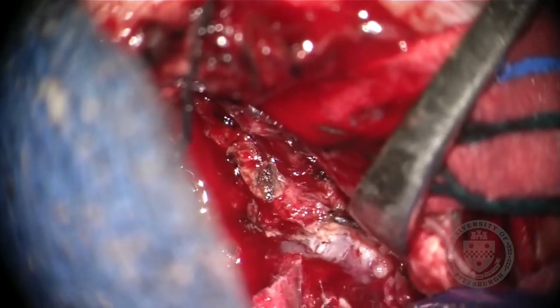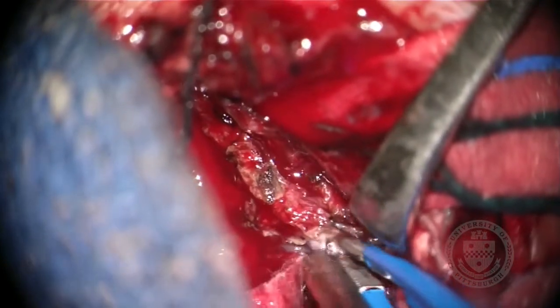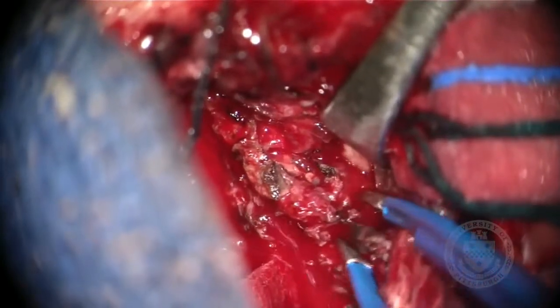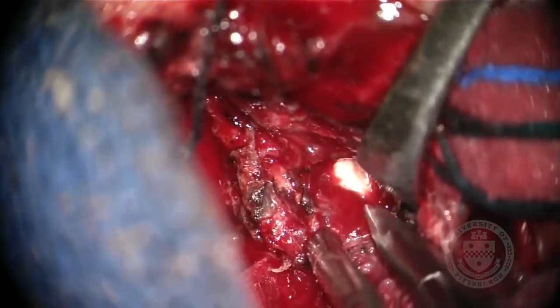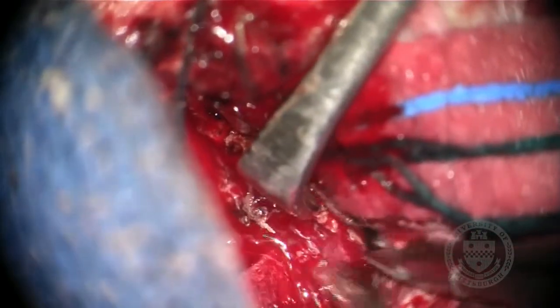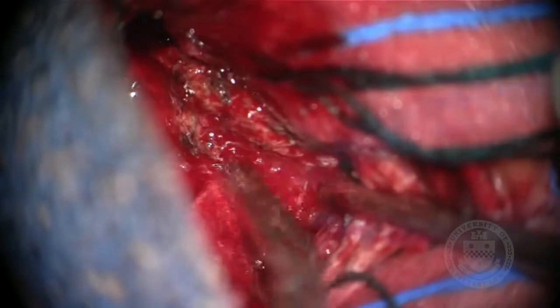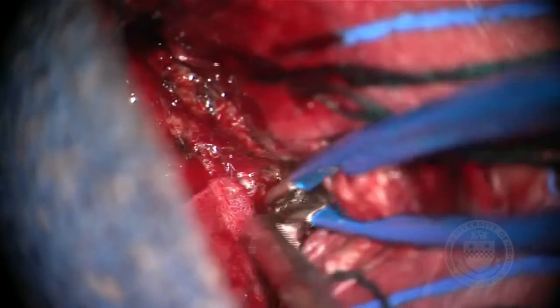This allows us to define the posterior extension of the tumor. We keep coagulating and debulking tumor carefully, continuing to see the interface with the brainstem and the extension of the tumor posteriorly towards the atrium. We keep coagulating the area of the dentate gyrus where the vascular supply to the tumor is coming from, and we aim at debulking all this area towards the brainstem interface. You can see the vascular supply coming from the medial aspect into the tumor, and we keep working our way towards the posterior aspect of the tumor that extends to the area of the atrium.